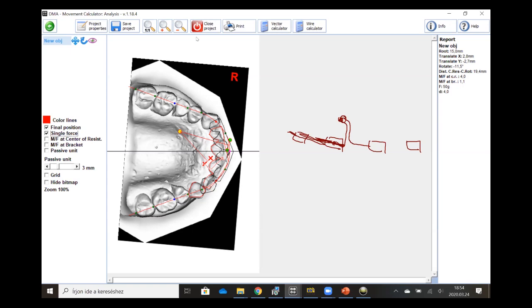Unfortunately, I don't think you can do it more than 5 or 6 millimeters. Patients could even accept 8 millimeters up here, but then this thing becomes too elastic, and when you activate it, it sticks out. When you apply the force here, the whole thing comes out because it's not rigid enough.